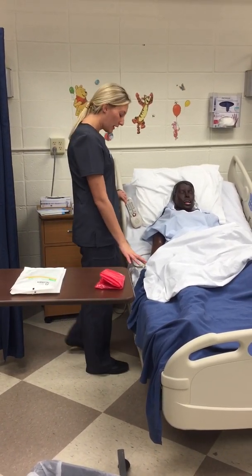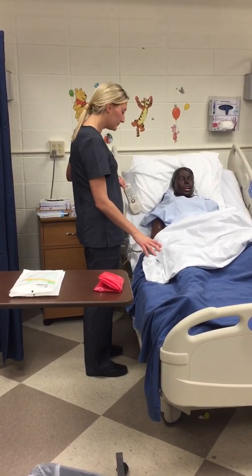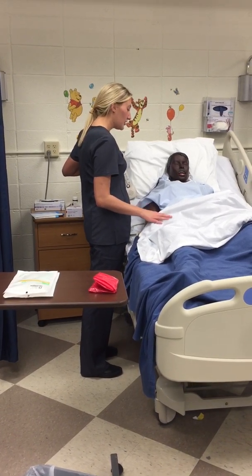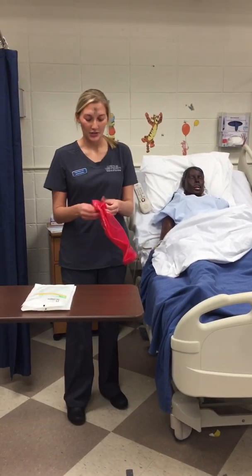So I'm going to go ahead and raise them up around my waist level so it's a comfortable working position for me. Alrighty, Mr. Jones, are you comfortable? Perfect. Go ahead and set up my biohazard bag.